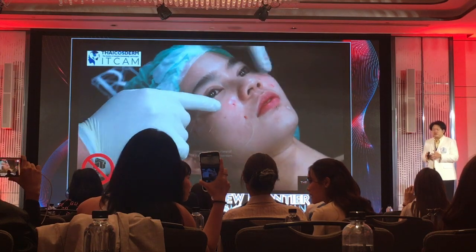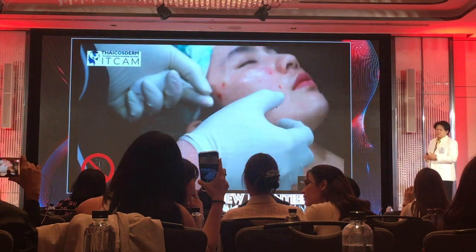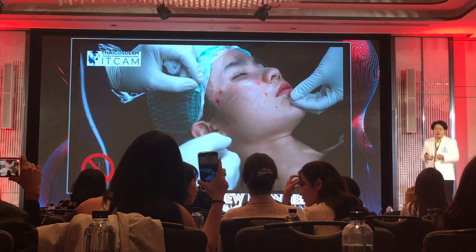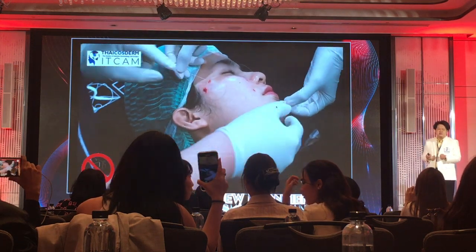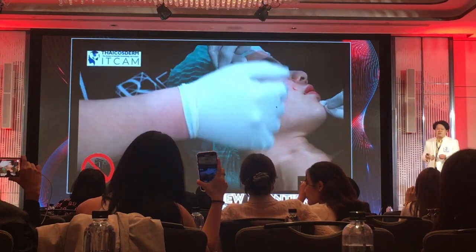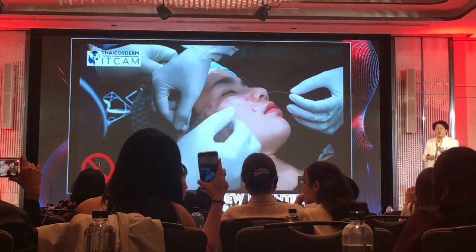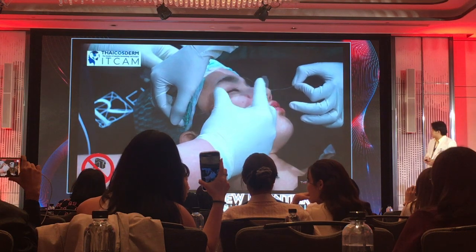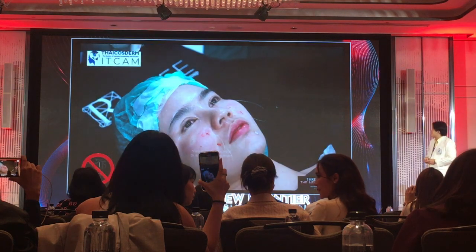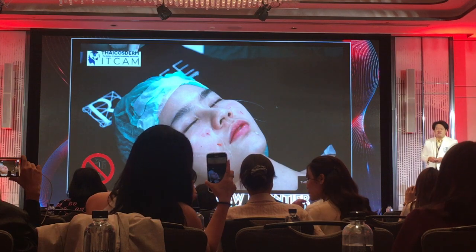You have to let your assistant help you a little bit. You have to let your assistant hold the thread for you. Then you can pinch. This technique will help to open the barbs. Because if you do not let the assistant help, the barbs may not open and it will not be effective, or the tissue will not activate at the point that you expect. You will see that it becomes the center that we need. Again, it is not that difficult if you do everything right.